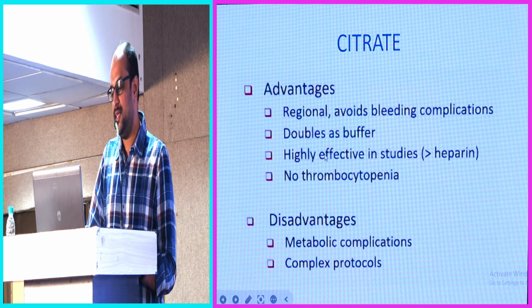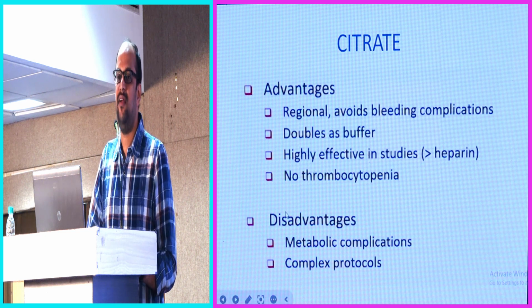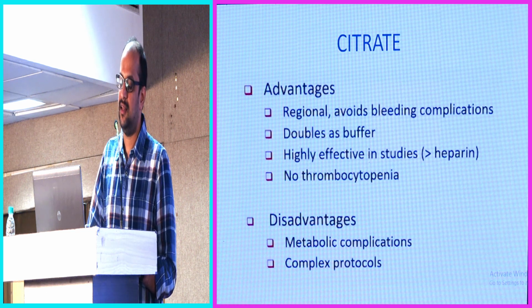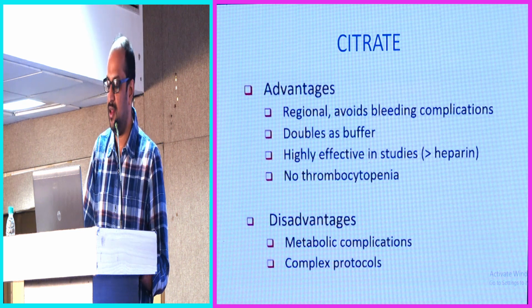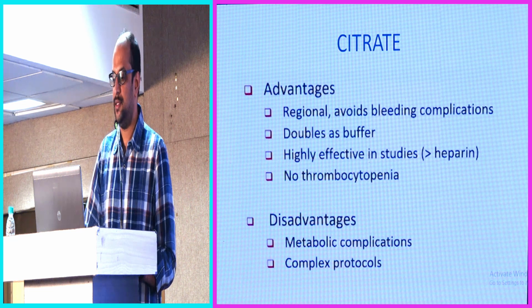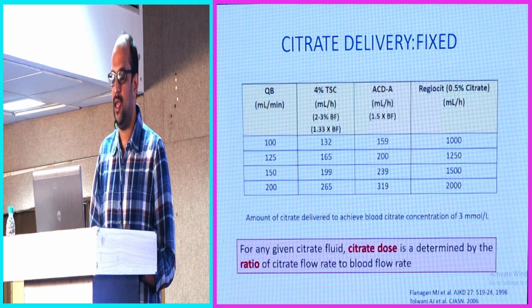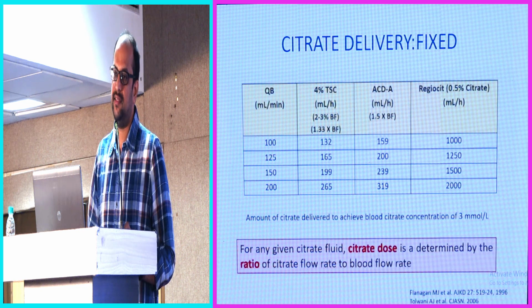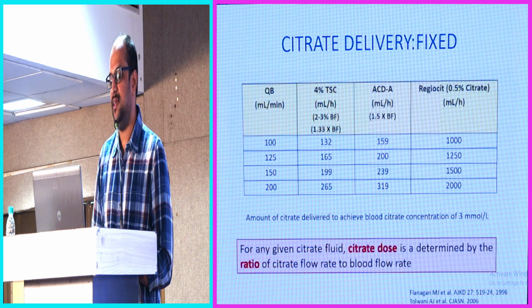And yes, it is very highly effective than heparin, and definitely it doesn't cause thrombocytopenia. Coming to the disadvantages, the important disadvantages are metabolic complications and complex protocols involved in the citrate anticoagulation. So if you want to give citrate to any patient, we can deliver it as a fixed dose, or we can deliver it based upon the post-filter ionized calcium.